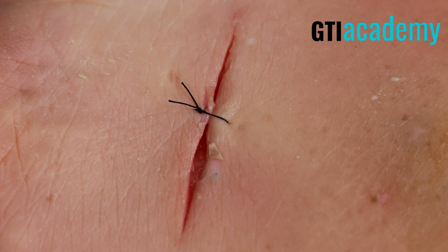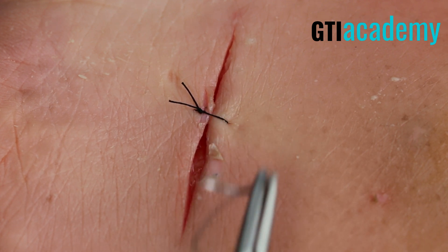It's really just a preference, but it allows the person taking the sutures out to do so more easily.